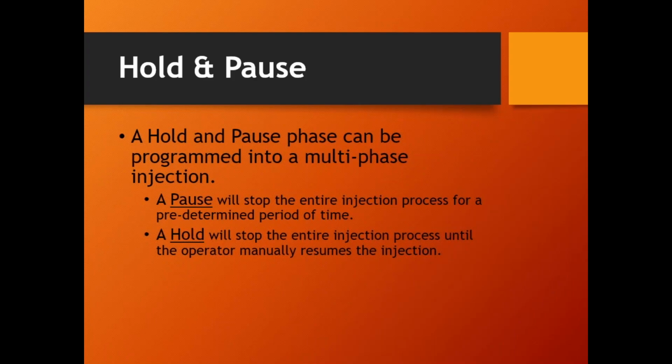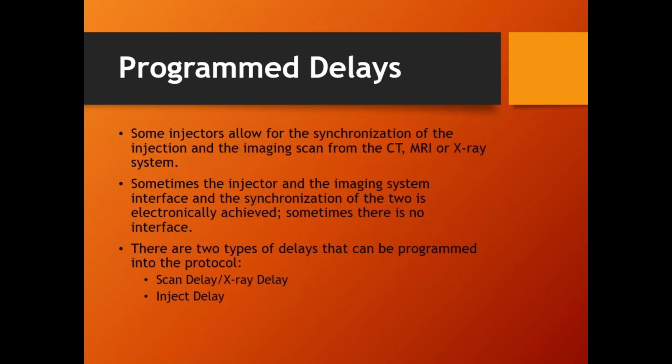Holds and pauses are actually very rarely used. Most of the time, if they want to stop between phases, it'll be a hold. So they control when we start it back up. Subtle difference, but it is a difference.